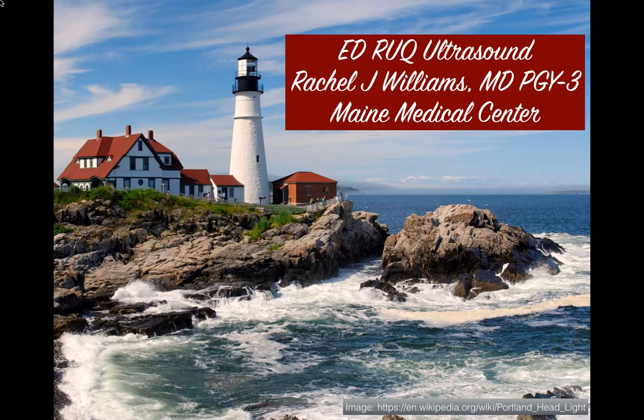This is a study here at Maine Med, which is always followed by a formal radiology ultrasound. However, depending on where you work, it's possibly a study that you may be credentialed to do independently and use in your clinical decision making. So, for that reason, it is important to know how to perform it and how to interpret the images.